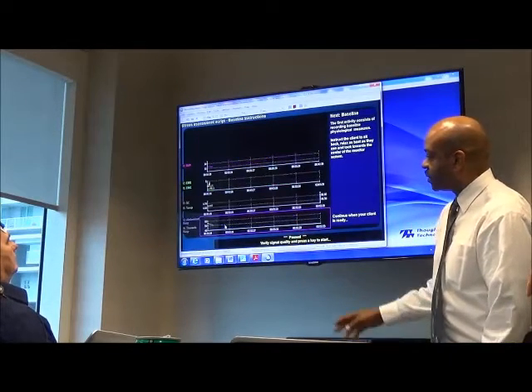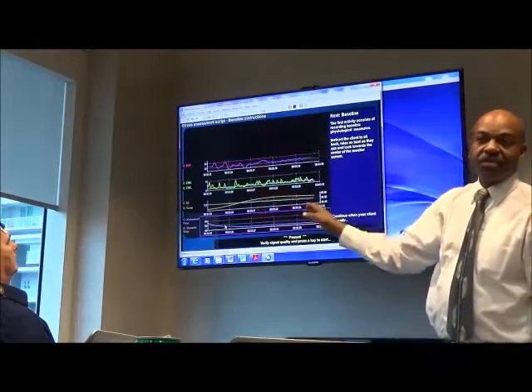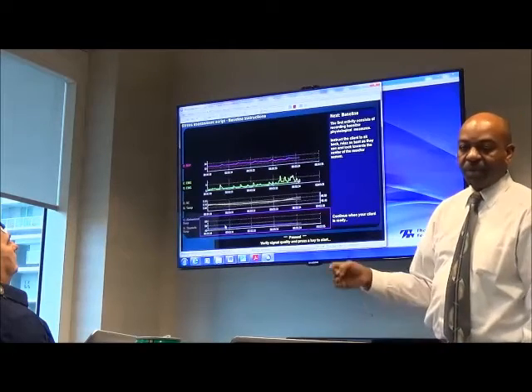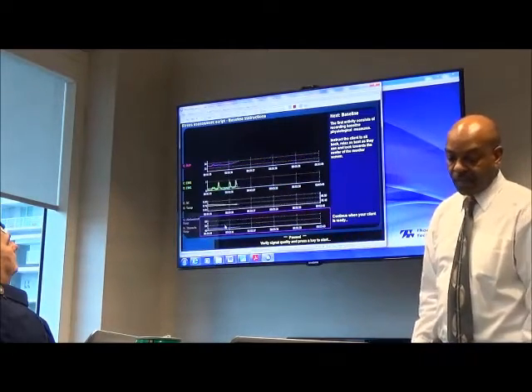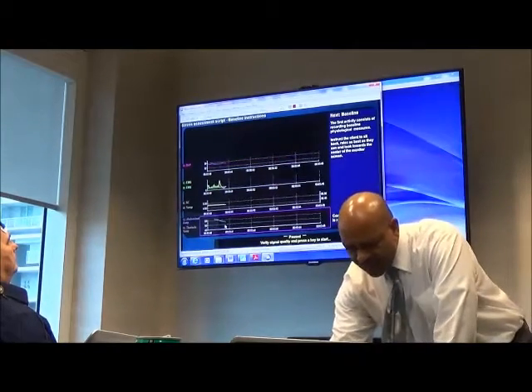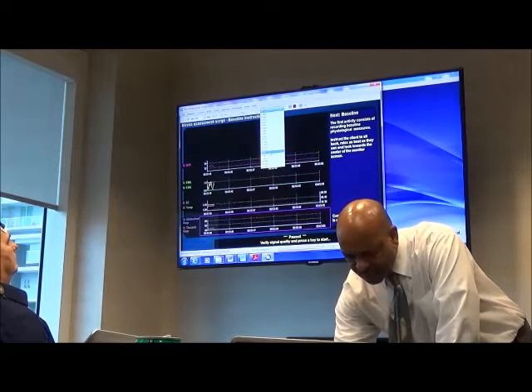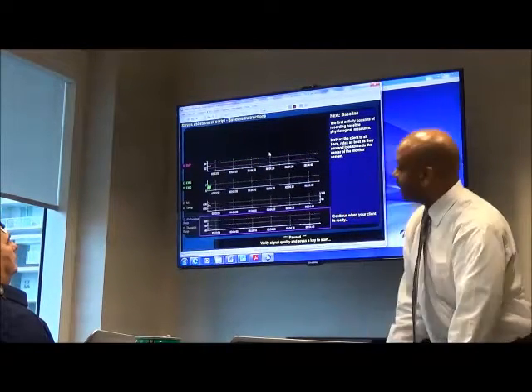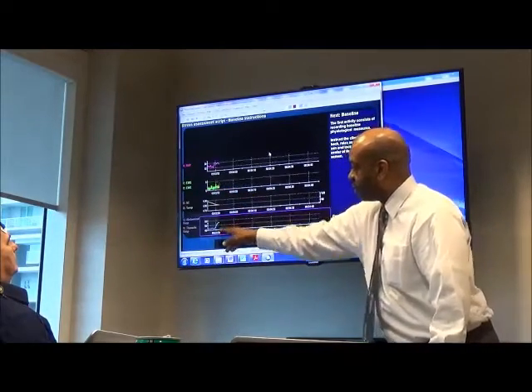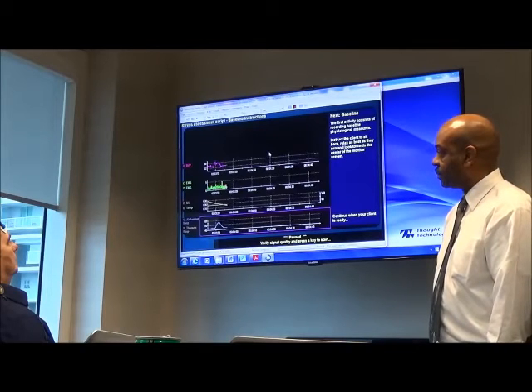And also the other thing is the time. It's only 5 seconds, which is a very short time to be looking at a breath. It would be more reasonable to have it on a minute. So there are some of those things that are not quite the way that you would normally have it set. So if I do a minute here, it changes everything, including the EMG and all, but you can see the breath much differently. Or half a minute, 30 seconds. Yeah, you can see the breath differently.